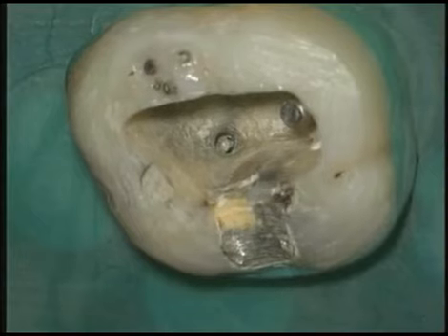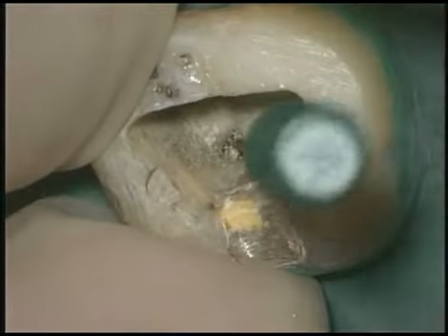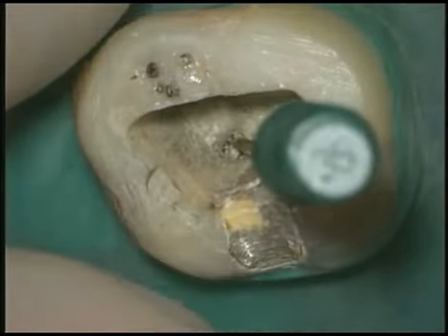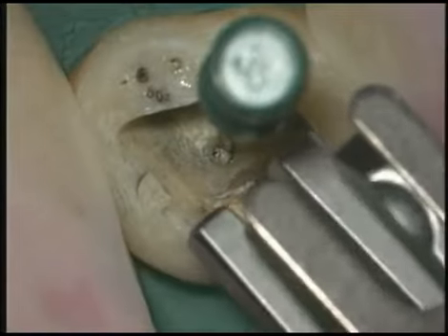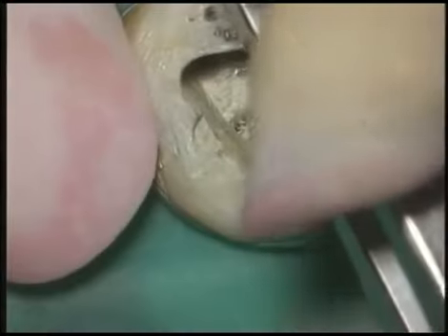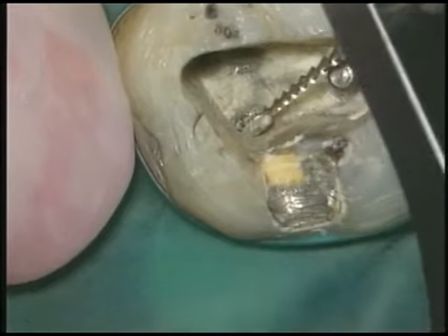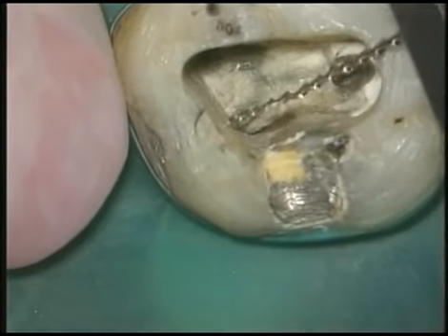At high mag, we can see how really exposed this silver point is. This will allow a 35 Hedstrom to be placed in the canal. Its cutting flutes will firmly engage the soft elemental silver. The extracting plier from the post-removal system is mounted, and by turning the screw knobs, the arms progressively open, and this force elevates out the silver point.